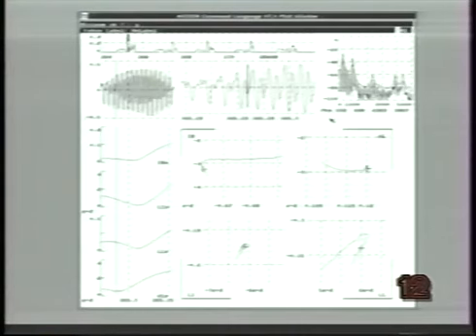With experimenter approval or correction if necessary, formant values, transducer coordinates, minimum velocity times, and correction index values are written to a text file for subsequent graphical and statistical analysis. This system is flexible, so it can be programmed readily to perform a wide variety of data extraction algorithms. It can also be helpful to examine articulatory trajectories for multiple repetitions of an utterance, to investigate directions of movement, trajectory shapes, and token-to-token variability.